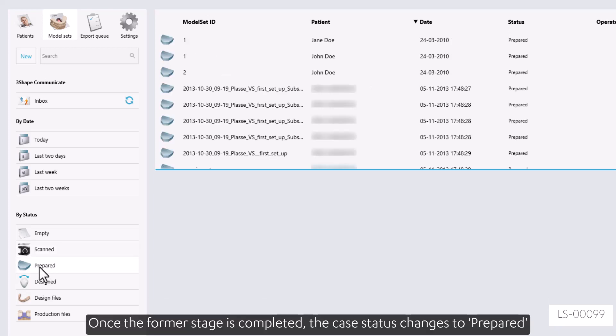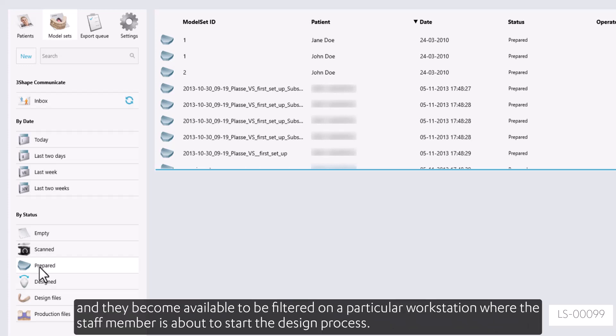Once the former stage is completed, the case status changes to prepared, and they become available to be filtered on a particular workstation where the staff member is about to start the design process.